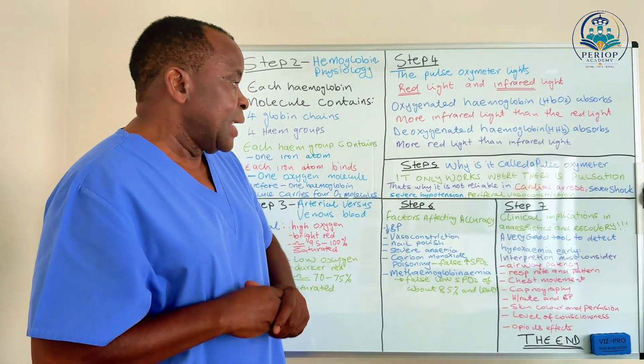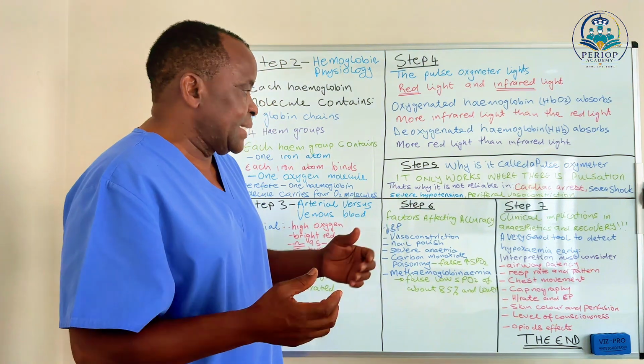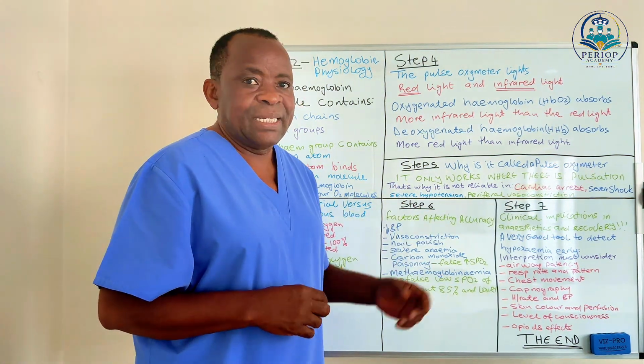And then finally, we want to see the clinical implications in anesthetics and recovery.